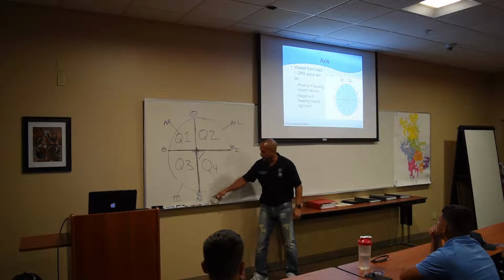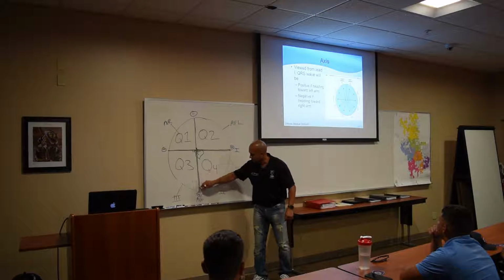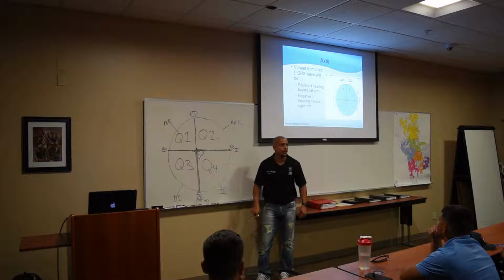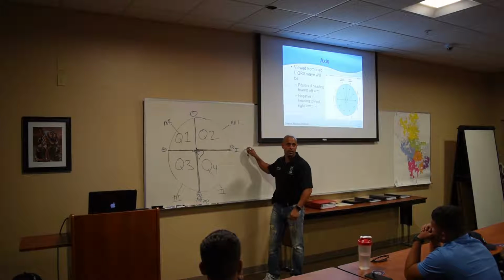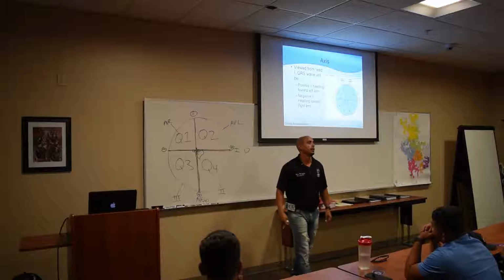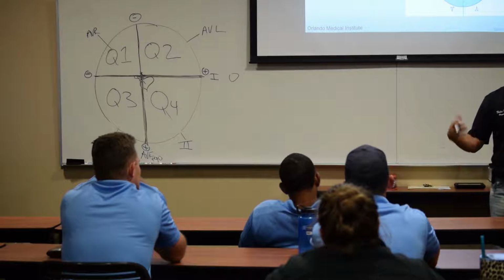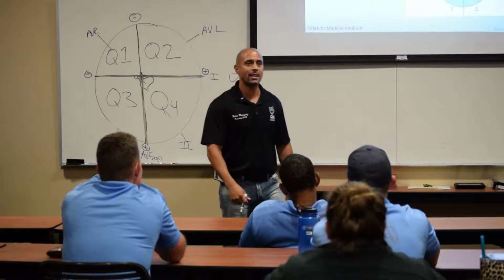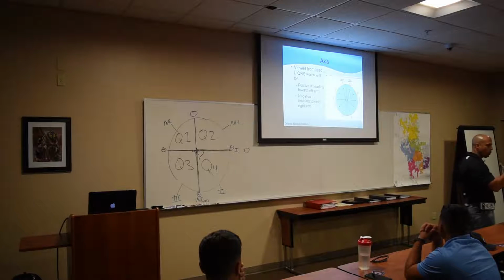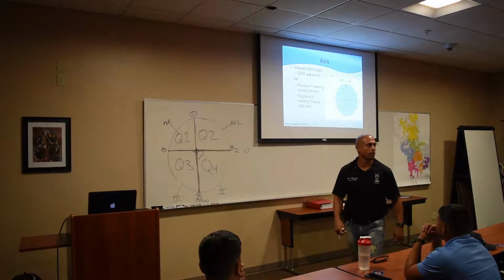So we have lead 1, AVF, right? So if I'm using this, this should be what? Positive, right? What degree is this? 90. So we put 90 right here. If I'm moving towards the positive, what kind of 90 would that be? A positive or negative 90? Positive, very good. So if that's 90, what degree is this? 0. So as a rough rule for normal axis, 0 to positive 90. If my axis is between 0 and positive 90, that's normal axis. What is that telling me? That my electricity is moving directly towards the positive the way it should. Normal axis. Everybody with me so far?